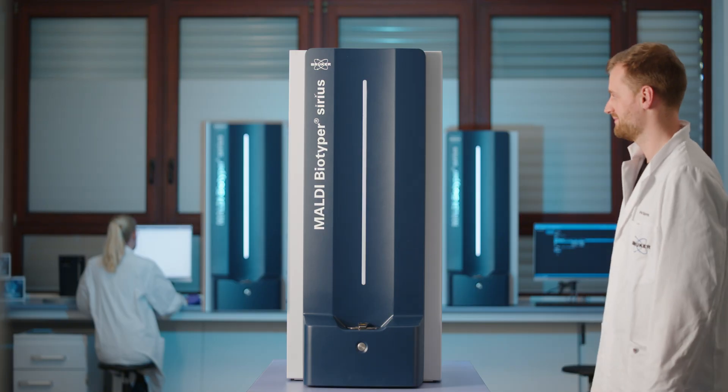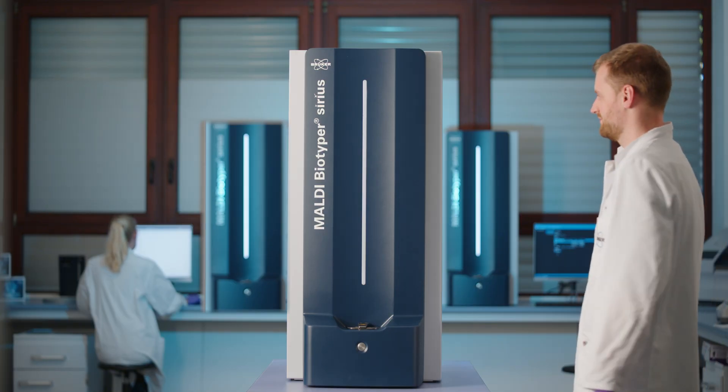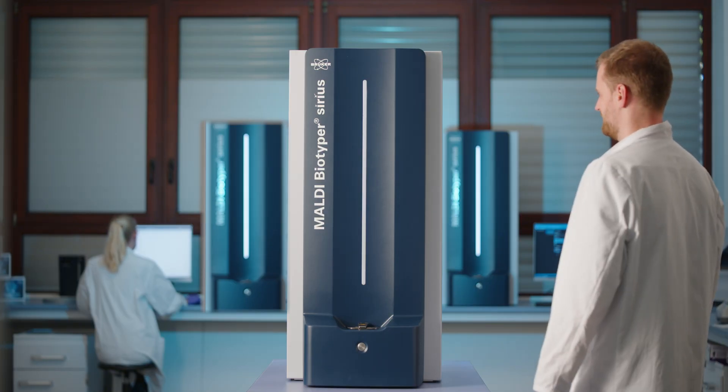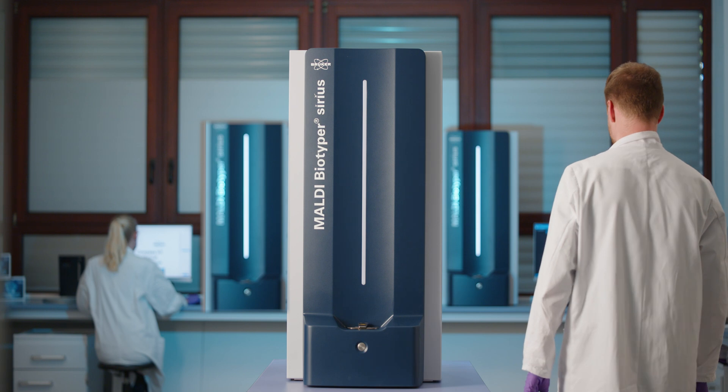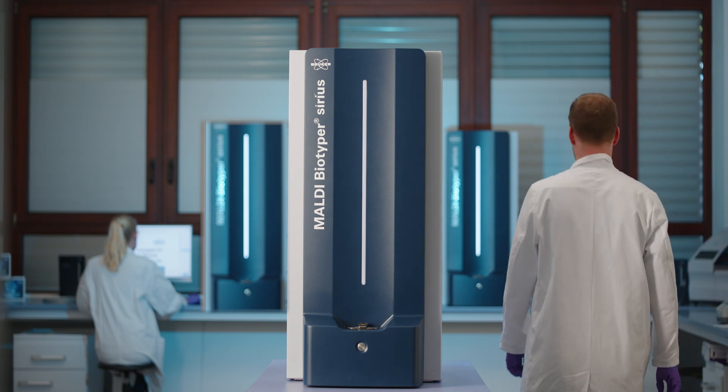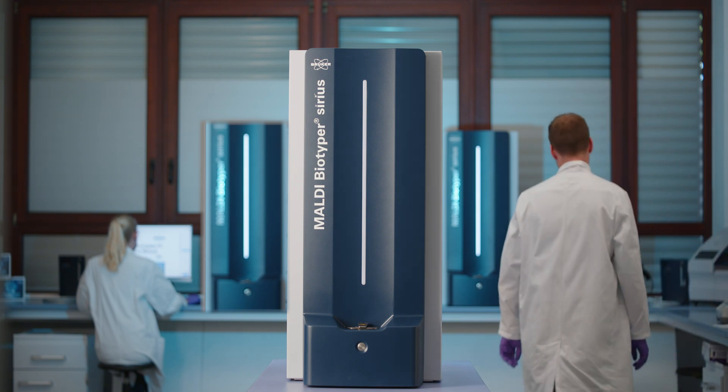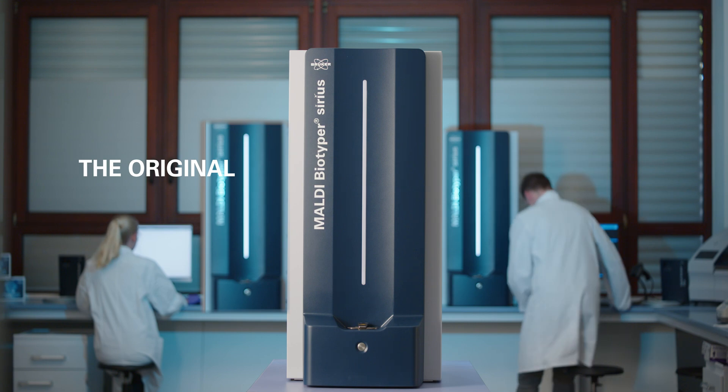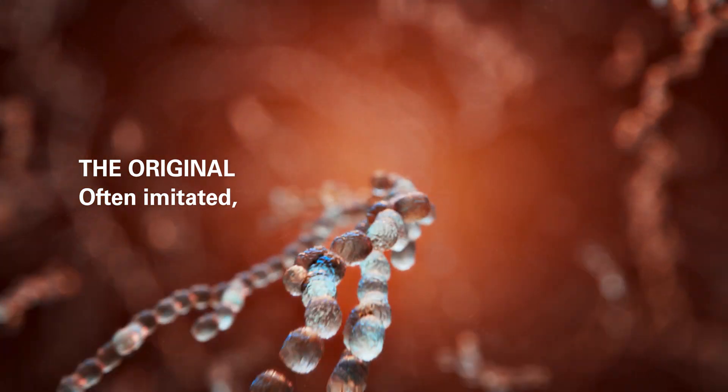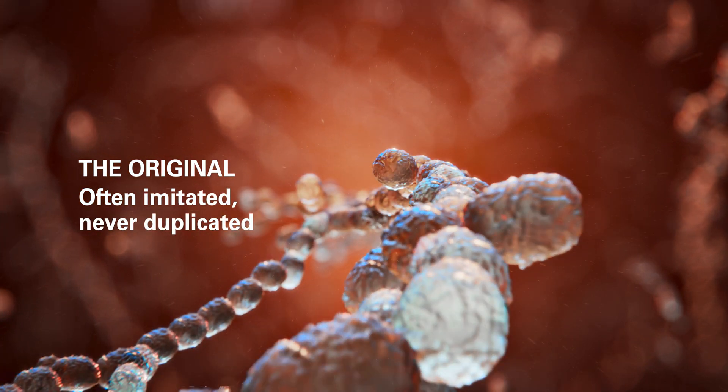Bruker's game-changing MALDI Biotyper. Decades of MALDI-TOF leadership, combined with in-house microbiology expertise. The original, often imitated, never duplicated.